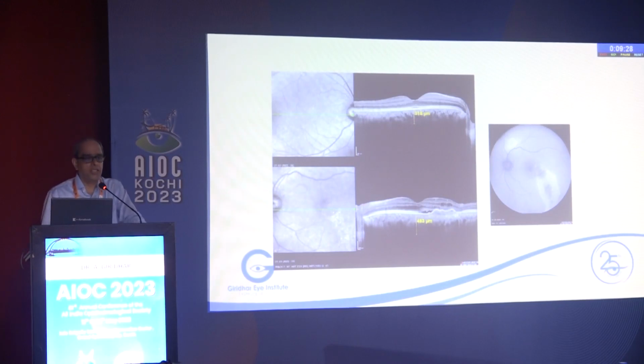Now I'm doing OCT. So first photograph CSR. Now OCT. Now in OCT, what is your diagnosis? You can see here OCT passing through that serous macular detachment. What is your diagnosis? So in the OCT also CSR? Looks like CSR or something else?